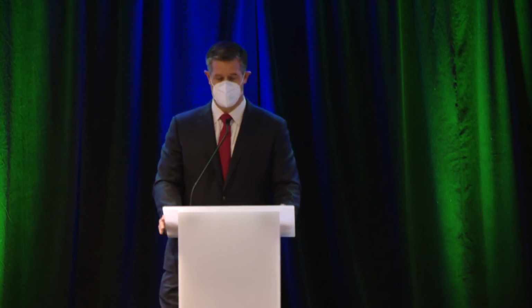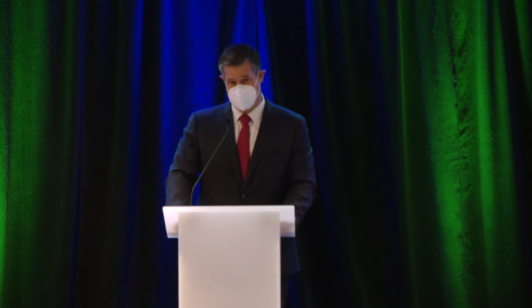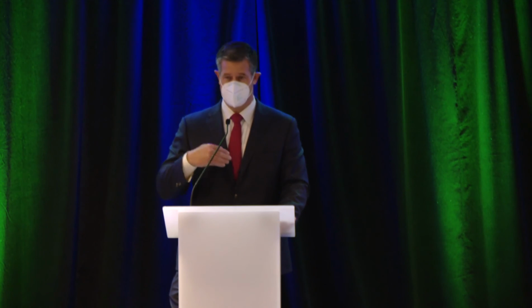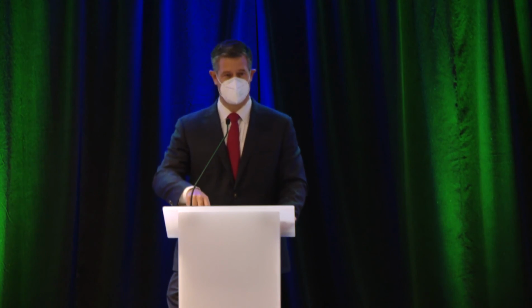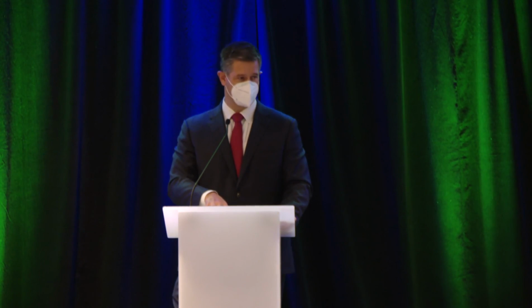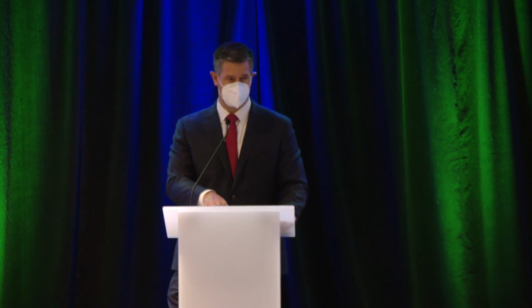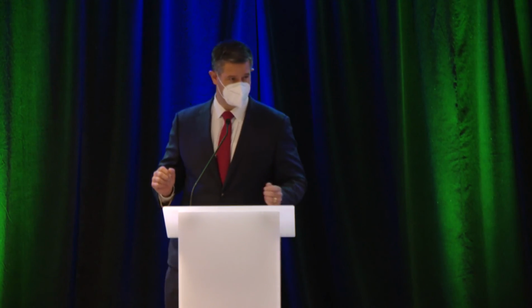And typically, I'm probably going to get stoned up here for saying this, but typically what I do is, if I know I don't have an adequate or appropriate gastric baseline, if I know it hasn't completely passed through the diaphragm, then what I will indicate is a qualitative assessment of the lower esophageal sphincter mechanism as I can see it, and indicate that there's been a technical problem in passing that catheter all the way down, and evaluate the peristalsis as we ordinarily would. That's what I personally do. I would love to hear from some of the other panel members how they deal with that.